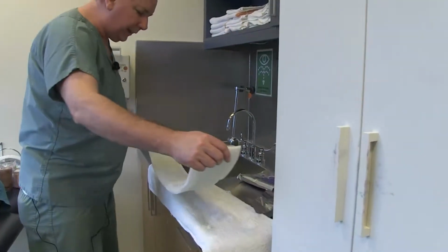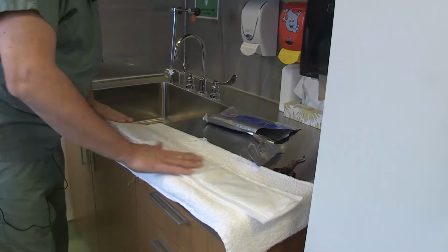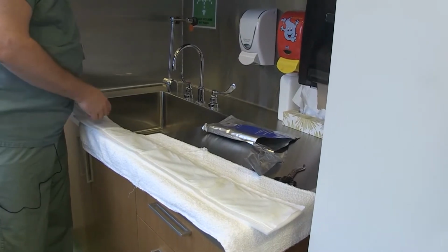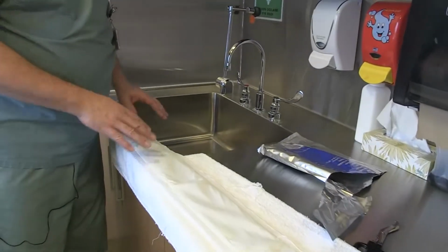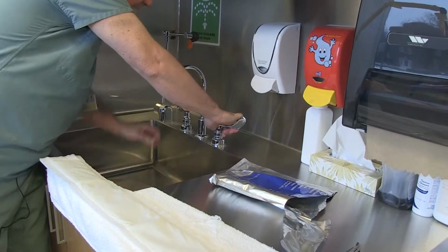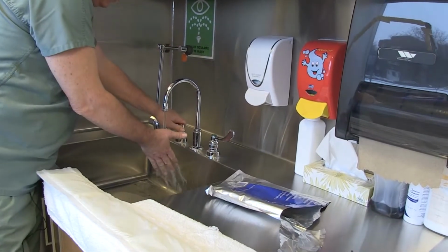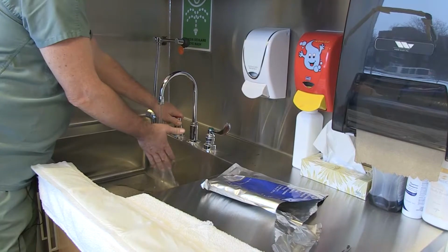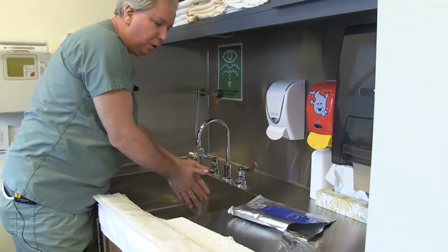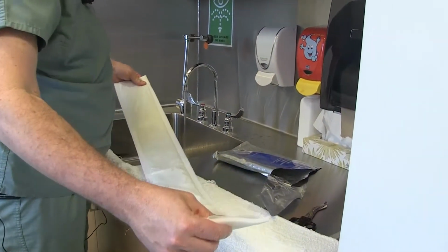So the way I will show you to dampen it in order to start the chemical reaction so it hardens, there are multiple ways. Some open it and dampen it directly, so the easiest way is the following. We use lukewarm to lukewarm cold water, never hot water. To have it lukewarm is for the patient's comfort. You have to know that the warmer the water, the quicker the chemical reaction processes, so the quicker the brace hardens.